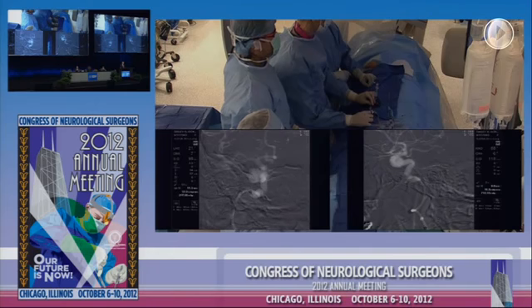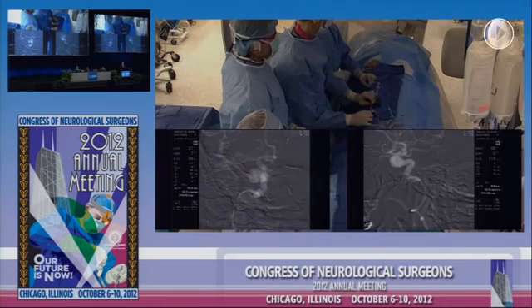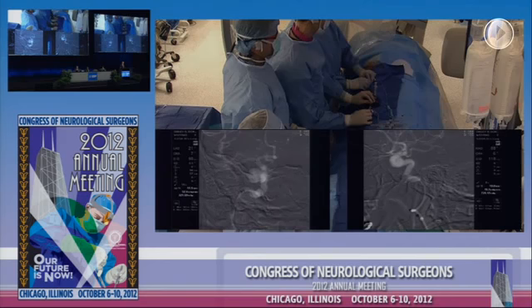So here comes that catheter again on the AP. We're at the ICA bifurcation. I need a little bit more on the reflex as we go. I'd like to get into the M1. Bring the shuttle if you can. Okay, watch out, you're losing the reflex.